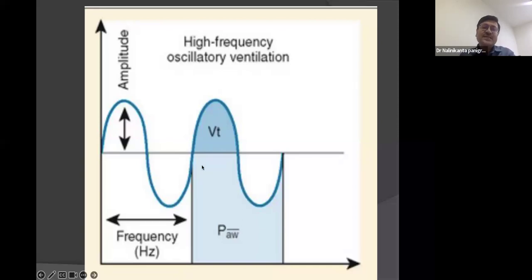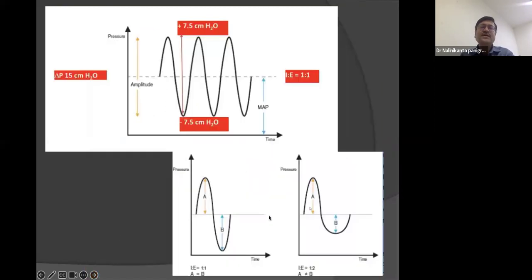In delta P, it's around the mark. There's a mean airway pressure which we are setting, and around that mark the amplitude movements happen. The amplitude wiggle happens: it goes in, the inspiration and expiration phase happens. And the inspiration and expiration look different with different I times.